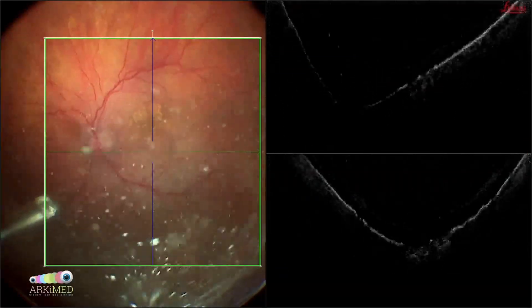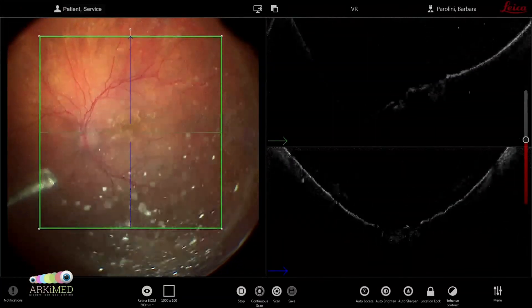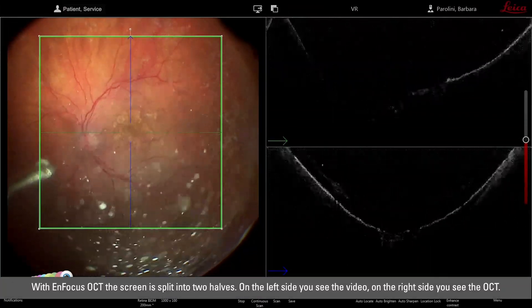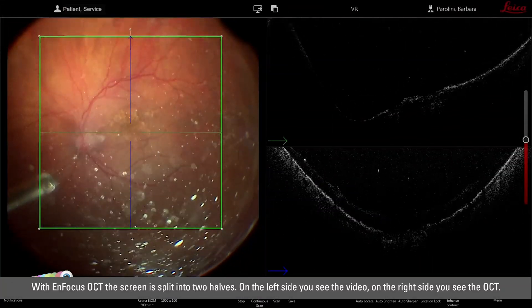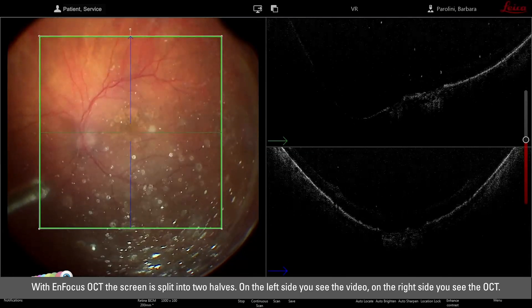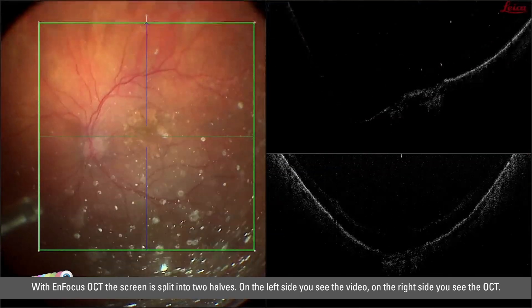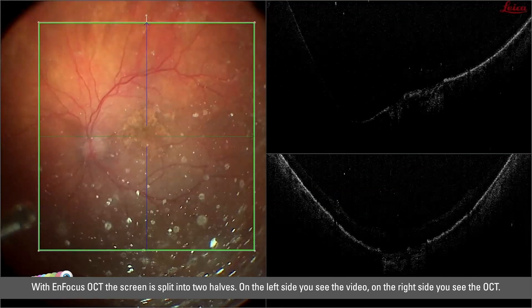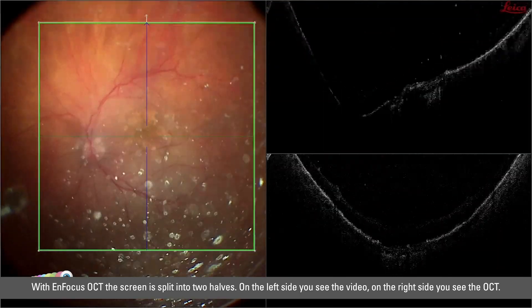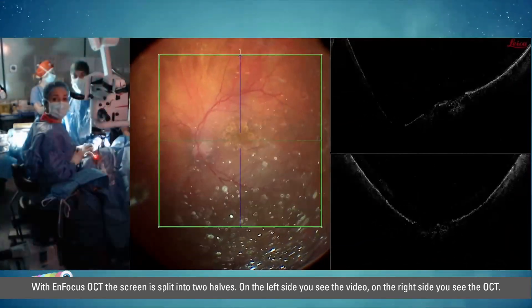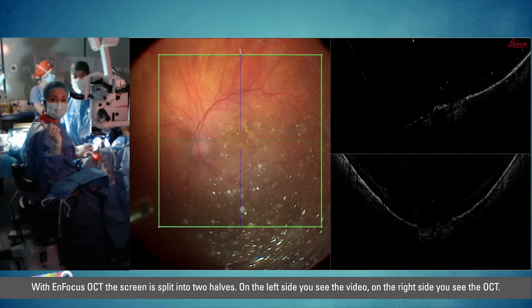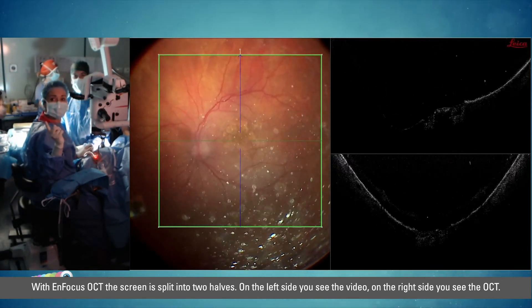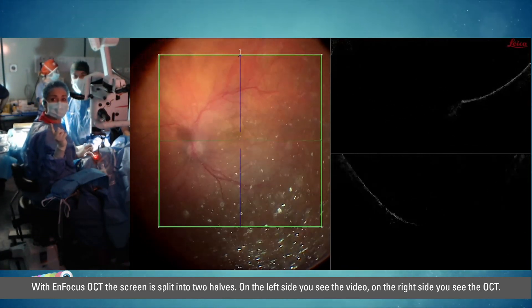In the new software of the EnFocus OCT we can split the screen in two halves. On the left side you see the video, on the right side you see the OCT.